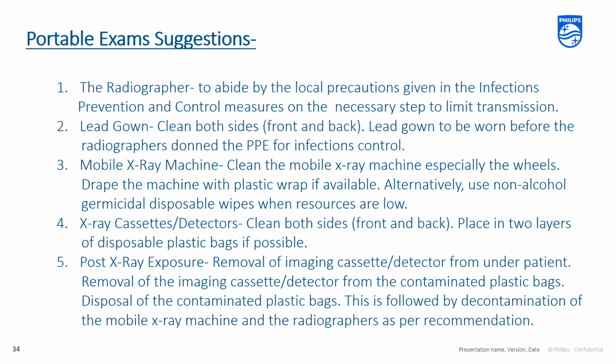For portable exam suggestions, the radiographer is to abide by all local precautions given in the infection prevention and control measures on the necessary steps to limit the transmission. When utilizing a lead gown, please clean both sides, front and back, before putting on your PPE. Clean the mobile x-ray, especially the wheels. Drape the machine with plastic wrap if possible, and alternatively use non-alcohol germicidal disposable wipes when resources are low.